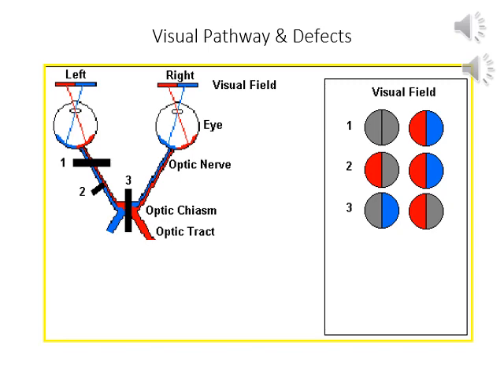Now for the right eye, the nasal fibers are the ones that cross over, and so they can't cross over because of the lesion at the optic chiasm, whereas the temporal retinal fibers of the right eye stay ipsilateral in the right hemisphere, and so they continue on. And so we see this pattern on the right.